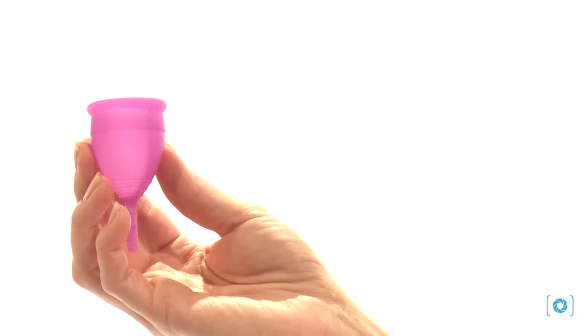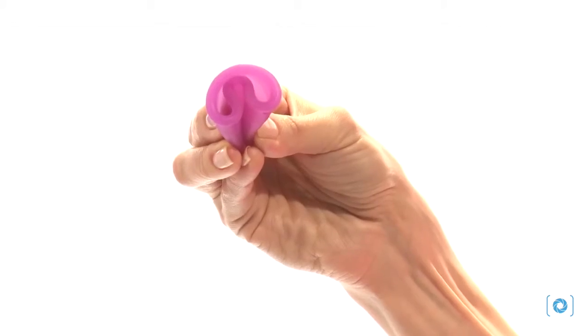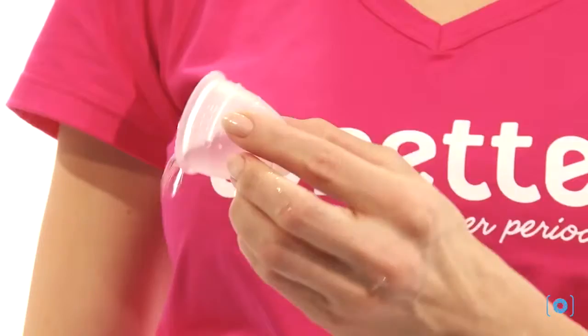Using the Lunette is easy. Fold, hold, insert, remove, rinse, wash, and use it again.